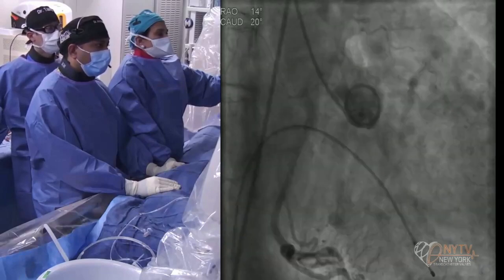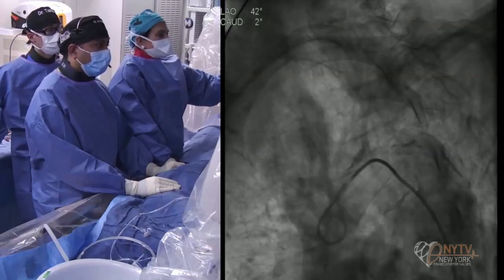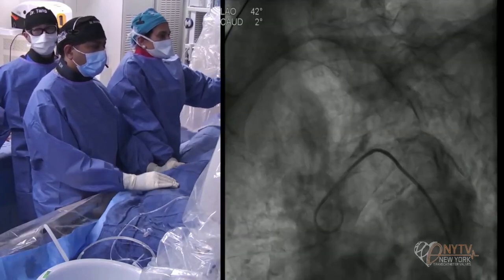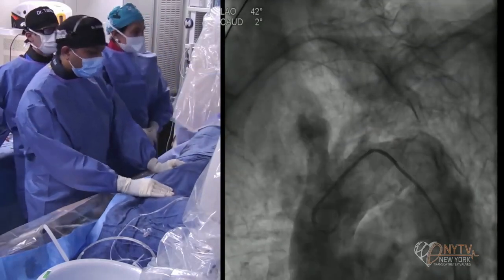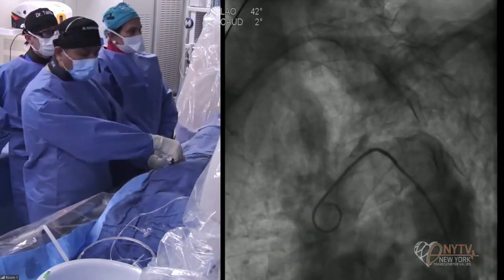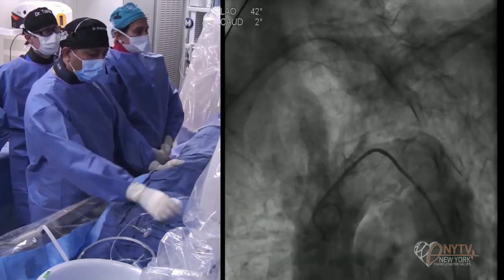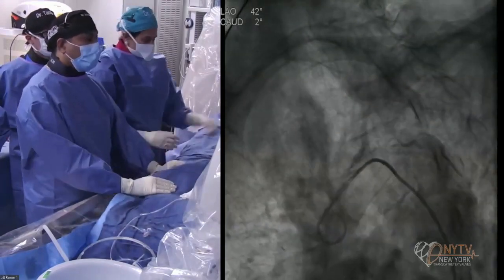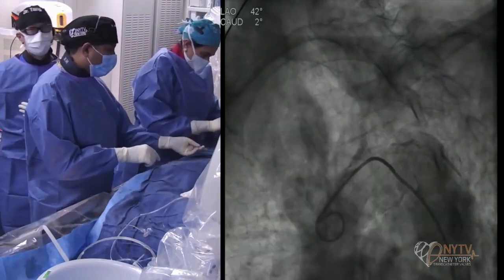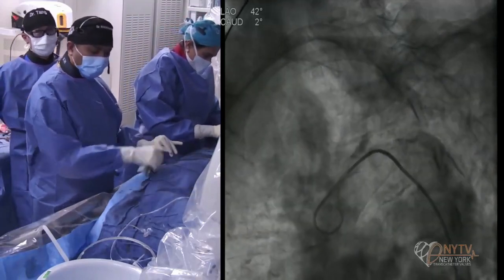And you can see the next slide being the arch angio. Very calcified. A lot of calcium and tortuosity in the vessels. Samir, would you have tried it at Cleveland Clinic? Yes, I do. What do you think about the great vessels? They are very big. Cerebral protection. Would you try advancing in this anatomy?